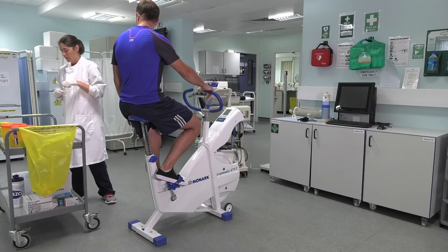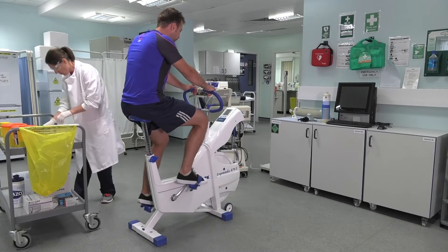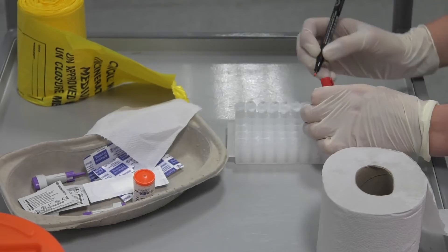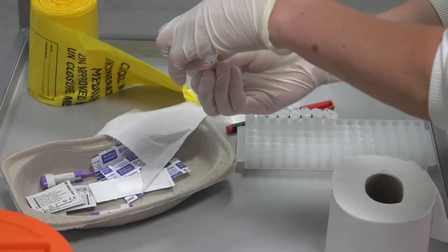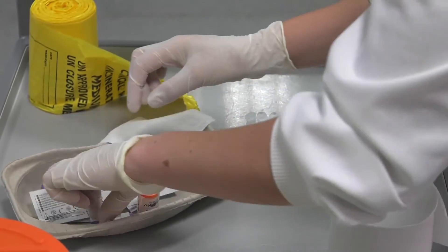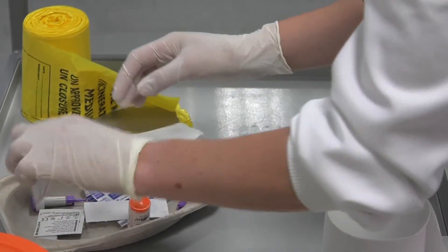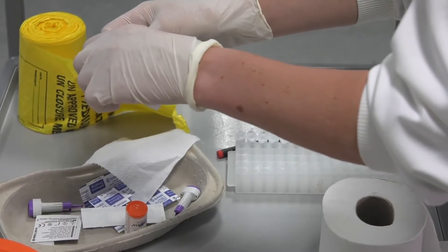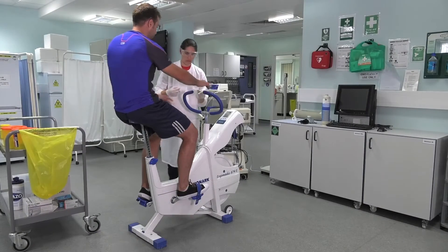If you're going to be doing a lactate threshold test, you need to prepare the blood tray for your resting sample. Make sure you're wearing a lab coat, you've got your goggles, and you've got your gloves on — do not roll your sleeves up. You've got your little tray, get your tube out, prepare your lancet, get the alcohol wipe out. You also need to have labelled your Eppendorf tube and then you're ready to go.